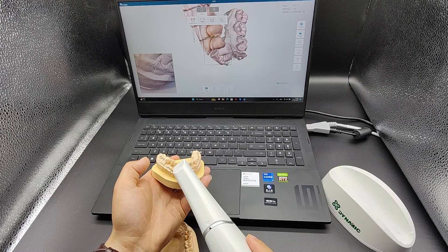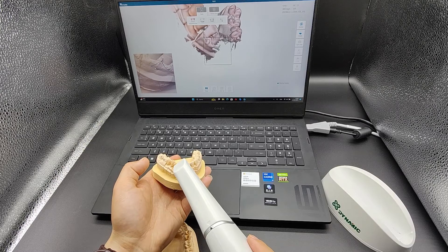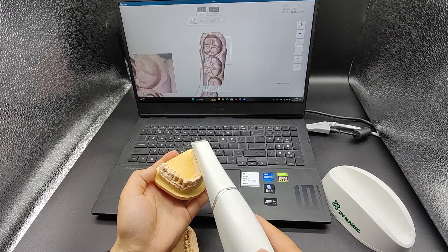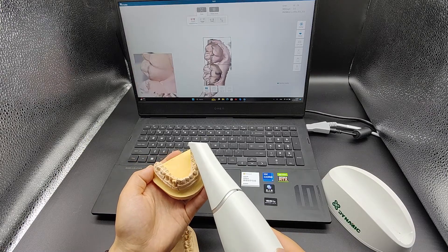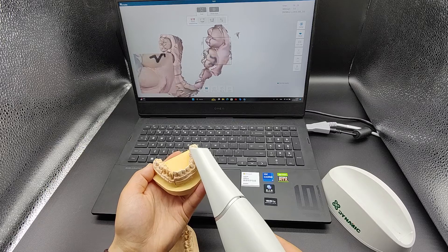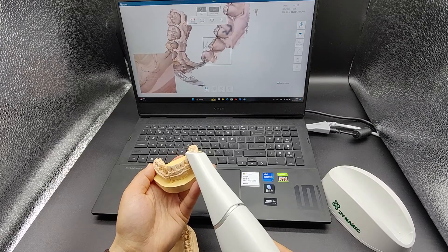To facilitate scanning, you can move the scanner to the occlusion surface of the other side at this point. Then rotate the scanner and continue scanning the buccal side.